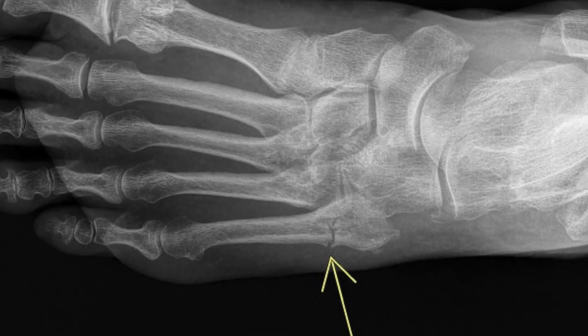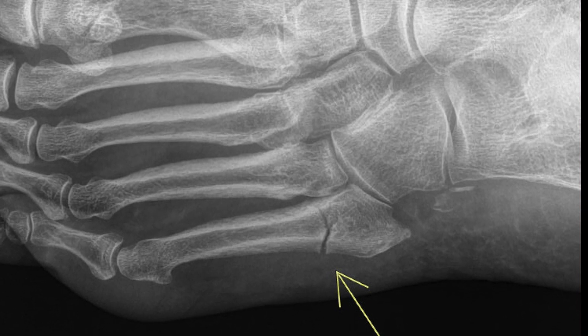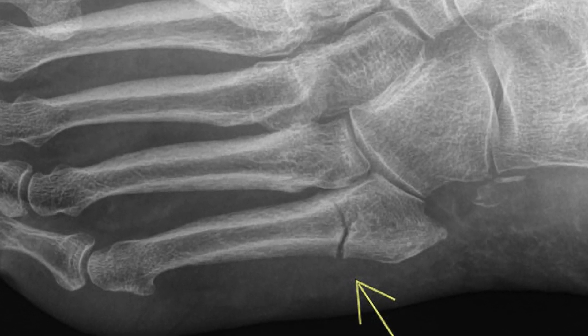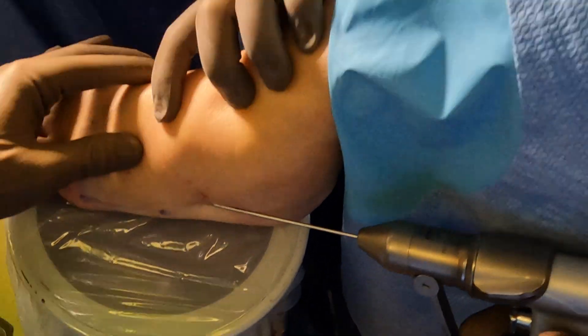What's up you guys, I'm Dr. Nick. In this video we are fixing a Jones fracture, which is a fracture of the fifth metatarsal. They have a high degree of low vascularity, so it's important to fix these.